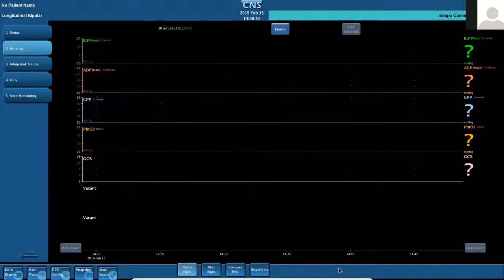I think this whole thing about there being multiple options for devices and naming your protocols according to the devices, just taking that protocol that you have that you like, and then replicating it like Tracy showed, plugging those measurements in and saving that as protocol dash equipment name, I think it's really going to save you time, and will give you that customization and flexibility to use the devices according to how you might roam the devices around in your unit.